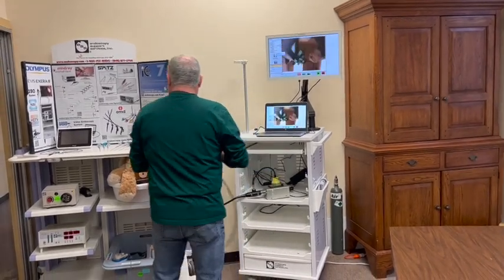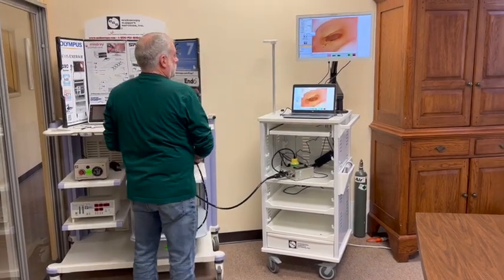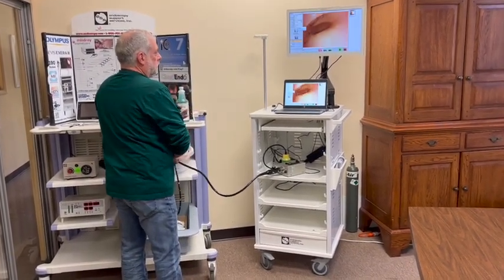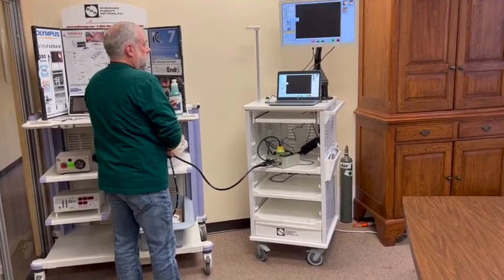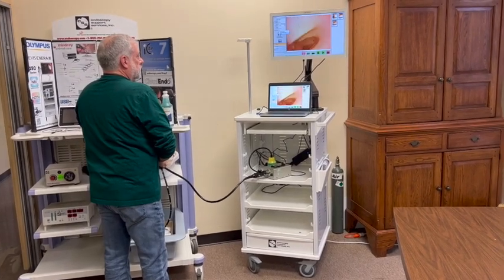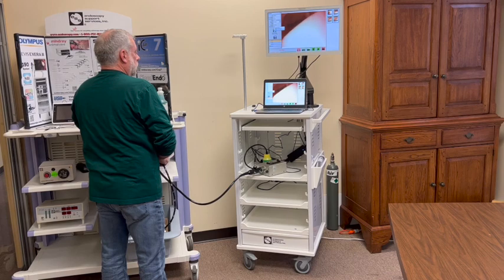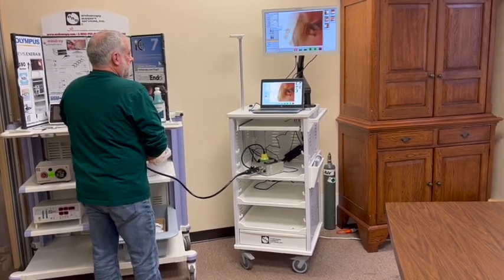I'm going to stick it here in my model and see my live image. I can take pictures from the scope by pressing the button. I can start video recording here on the endoscope as I'm scoping, and continue to take photos while the video is recording.